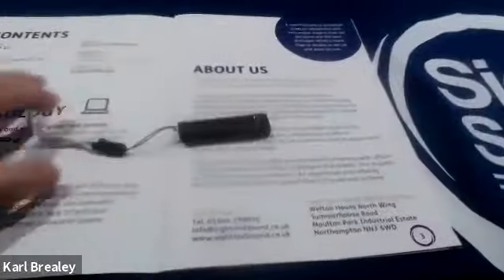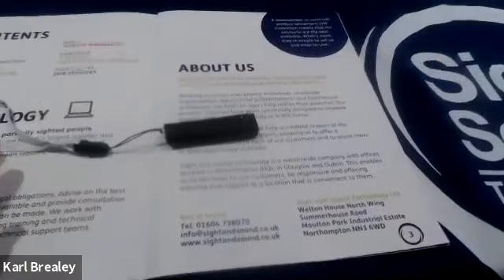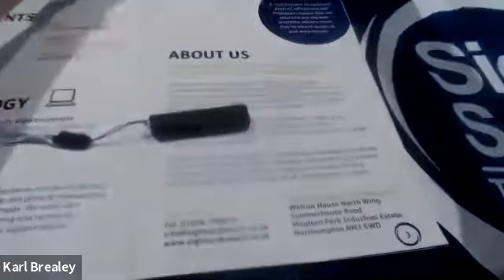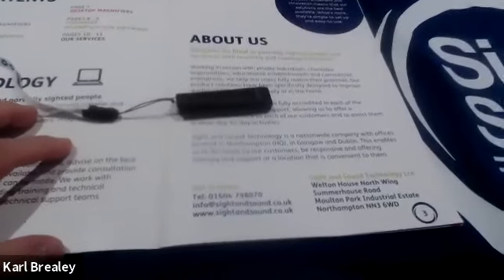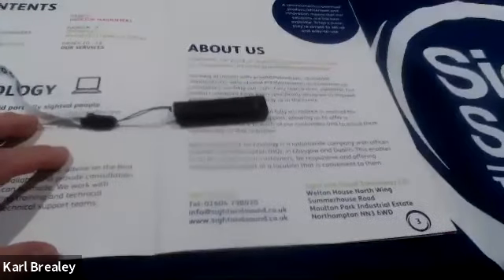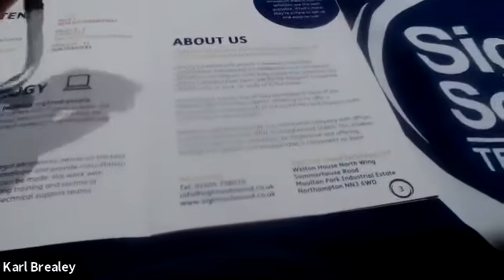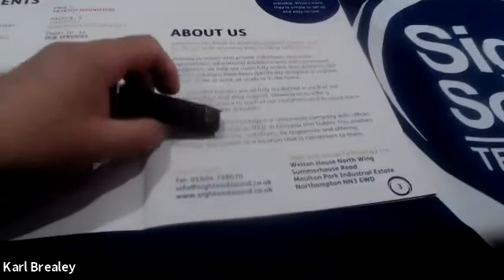This one's tiny, mate, in comparison. Yeah, the 2016 one was about £2,000, but because of the exhibition it was discounted to £1,600. They've changed the technology no end. When you think about the size of the last one, the size of the battery pack that came with it, it's not far off the size of these rechargeable power blocks. The unit was about 5.5, 6 inches long by 1 inch deep by about 2.5, 3 inches wide, connected to a cable and then onto glasses. That technology has now been shrunk down into something not much bigger than a thumb drive. Having that ability, the costs do tend to go up quite considerably.